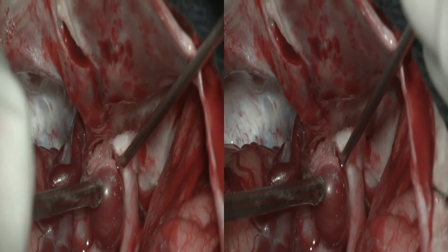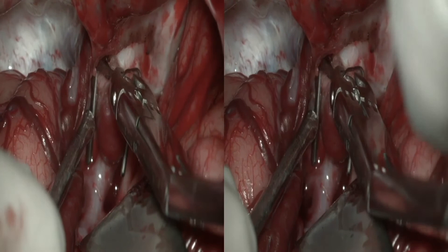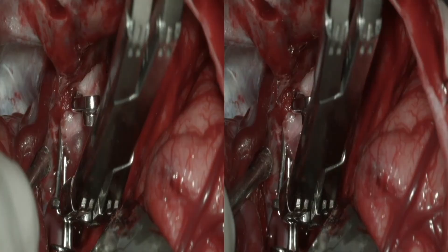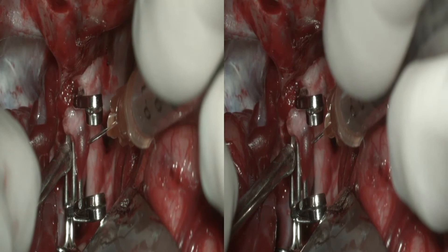After identifying the distal and proximal neck of the aneurysm, reconstruction was started by placing a 90-degree clip in an anteroposterior direction. Then a second clip was placed in the posterior-anterior direction, and puncturing the aneurysm confirmed that aneurysmal flow is still present with small bleeding.